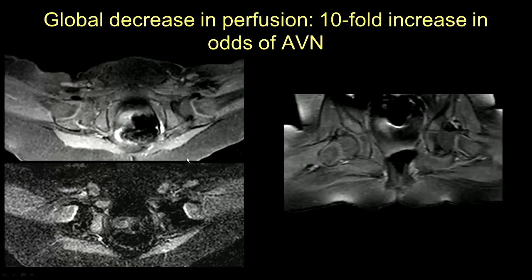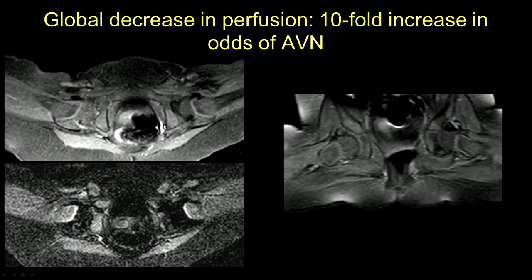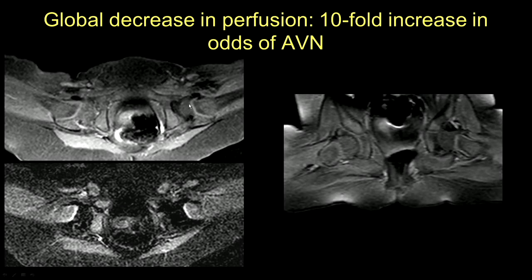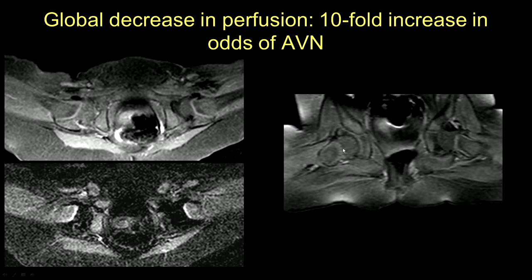Contrast that with this patient. After gadolinium, you can see normal vascular canals on one side. On the other side, on regular imaging, you're not sure if you see normal vascular canals. But on the subtraction image, you can see that the femoral head is very black. Similarly on the coronal image, notice the normal vascular canals, and then the cartilage which has less signal intensity — you cannot see the vascular canals.